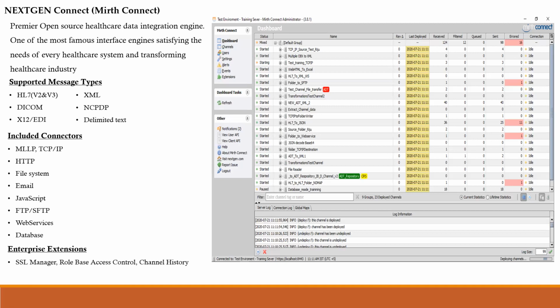You can deploy interfaces in production. There is no limitation on how you can run the product. Everything is the same even if you go for an enterprise plan. You do have a few billable plans that you can choose from, but they are not for the product. They are for the support aspects from the Mirth Connect organization.